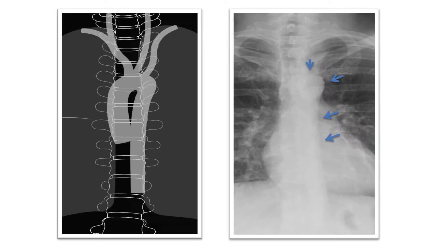Because the aorta arches, we can predict that its shape will be that of a white arch or white candy cane. Note that even though we do not see the medial border of the aorta, we can still perceive its shape. The reason we don't see the medial border is because the medial border of the aorta is silhouetted with other anatomical structures within the mediastinum.